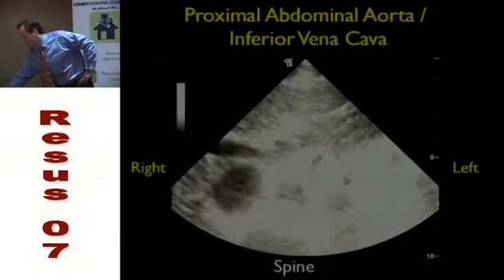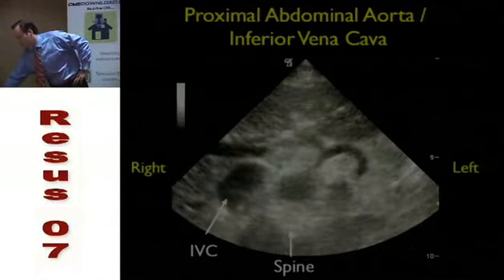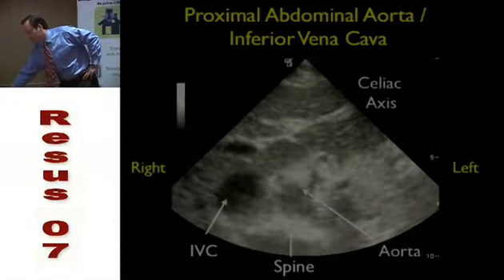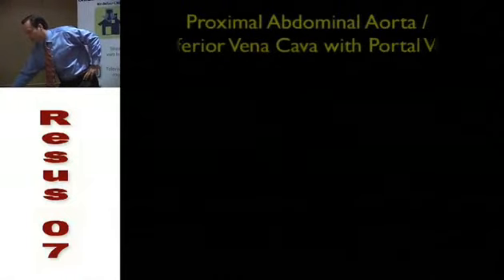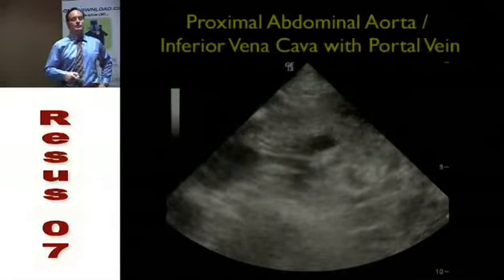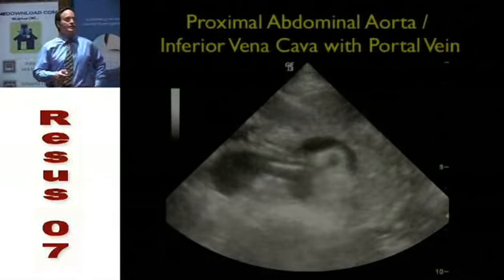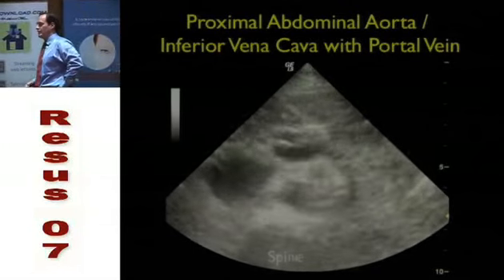about that. One important structure that I wanted to show you there was the portal vein just looping across, and it's going to be coming right over the top. Again, there's the celiac axis. You'll notice the celiac axis on this next one right here. Okay? And here's actually your celiac, again. And this structure right here is your portal vein coming right over the top. Okay? This little structure here is actually your superior mesenteric artery. And I'll show that again on a better image coming up.